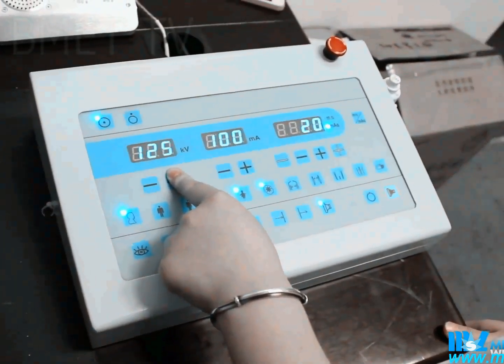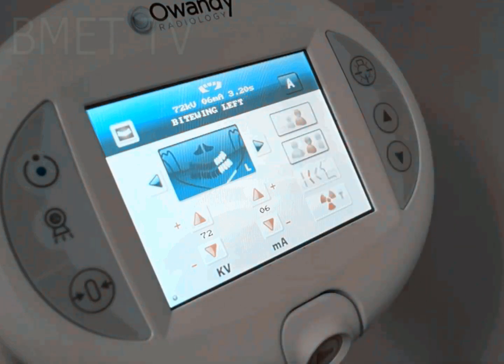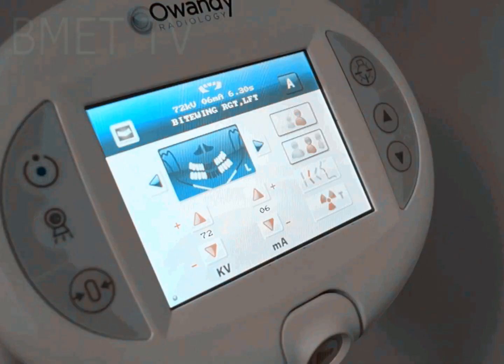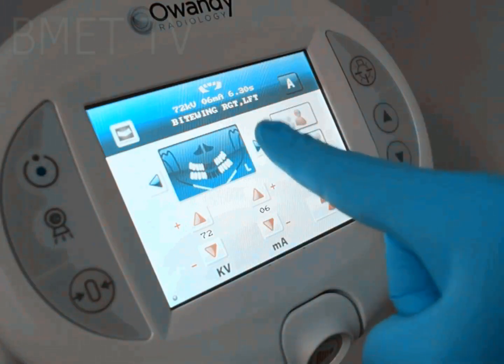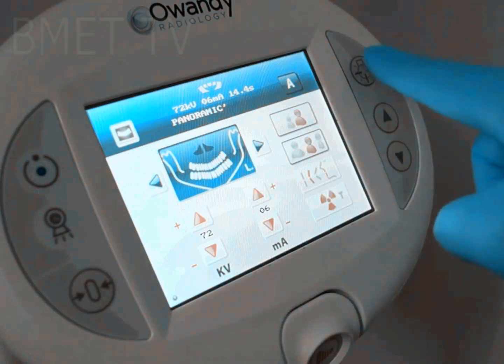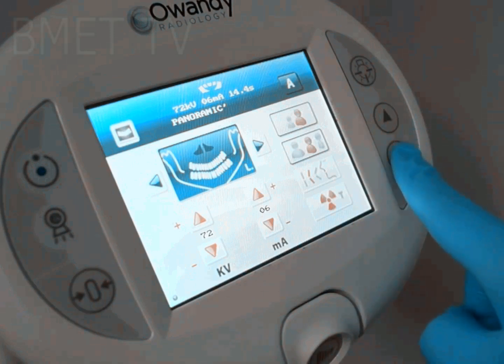kVp controls the property called radiographic contrast of an X-ray image, the ratio of transmitted radiation through regions of different thickness or density. Each body part contains a certain type of cellular composition which requires an X-ray beam with a certain kVp to penetrate it. The body part is said to have subject contrast, that is, different cellular makeup. Some dense, some not so dense tissues, all within a specific body part.